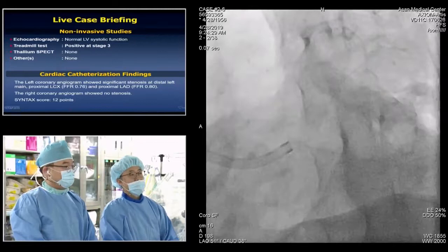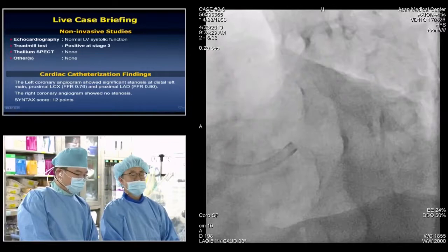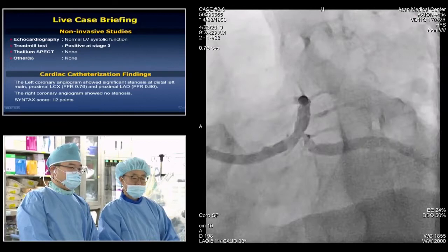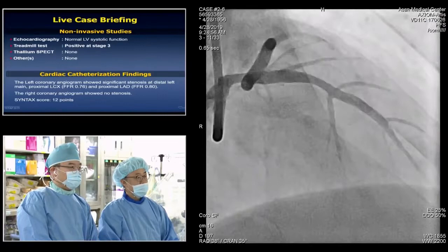In this case, absolutely not. I think PCI is a good strategy. The reason I say that is in this particular patient with an FFR of 0.8 to the LAD, you would be worried about the use of a mammary artery and the risk of competitive flow. So I think in this patient, a strategy of PCI is very reasonable.